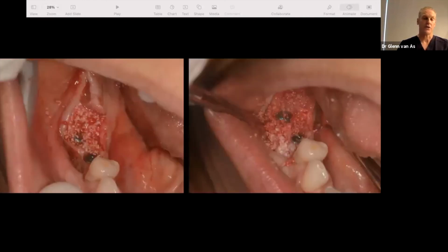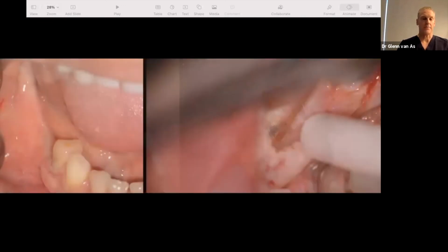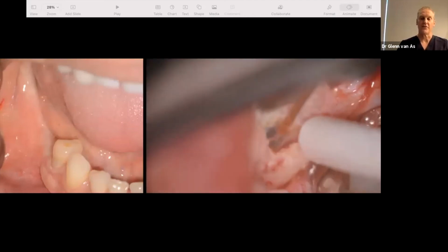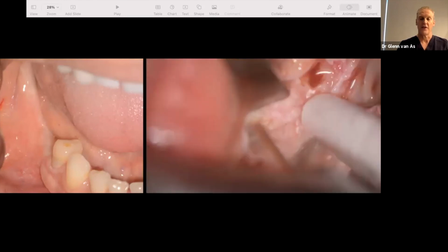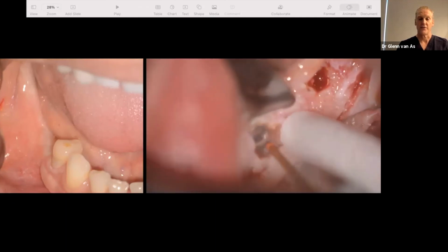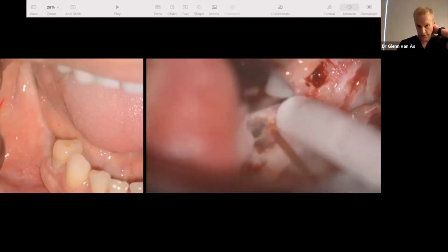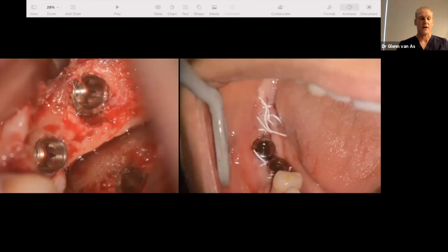And then we graft the bone over top, put a resorbable membrane, in this case, tacked it over, and had full closure with Gore-Tex sutures. Patient came back in 3 months, and we're going to uncover. And what's kind of cool, actually, as you can see, there's actually bone formation over top of the fixture. And I'm using the laser in this case to remove some of the bone overlying the fixture, because there's so much bone growth over top. I had to remove the bone over top of the cover screw. Immediately thereafter, you can see the bone formation around the fixtures, the healing abutments.